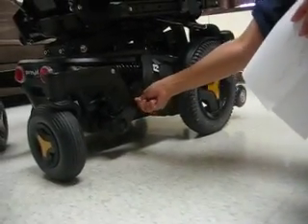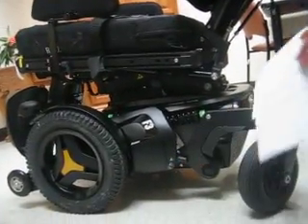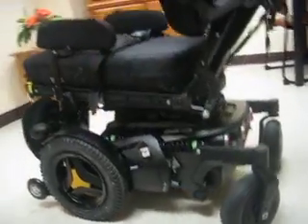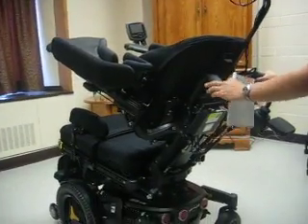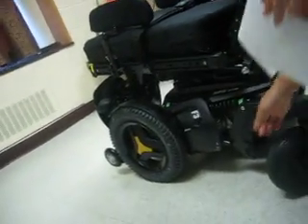Push down on that side and on the other side. The parking brake is now off and the chair is in freewheel mode, and you can push the chair into position next to the patient's bedside. Then apply the parking brakes back on.